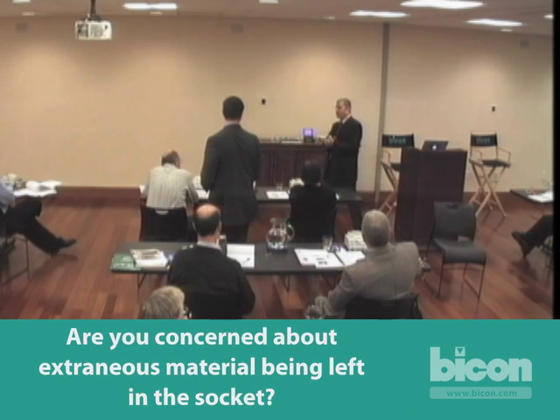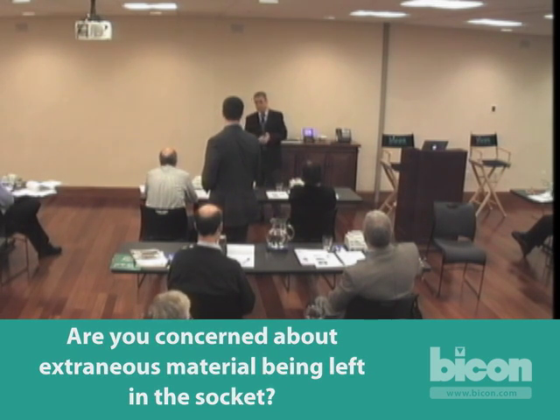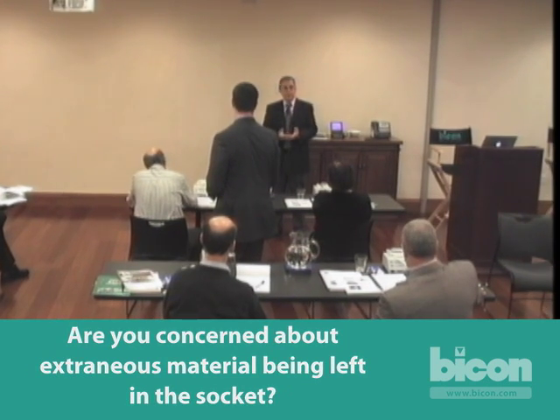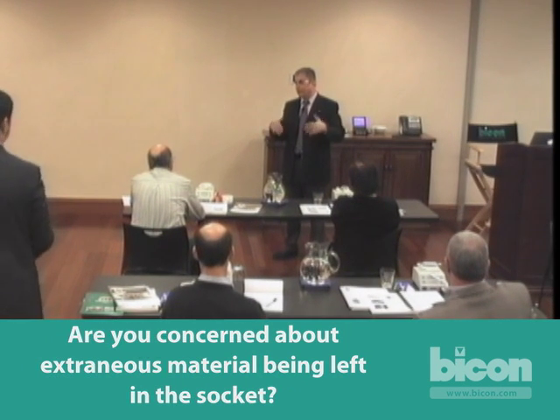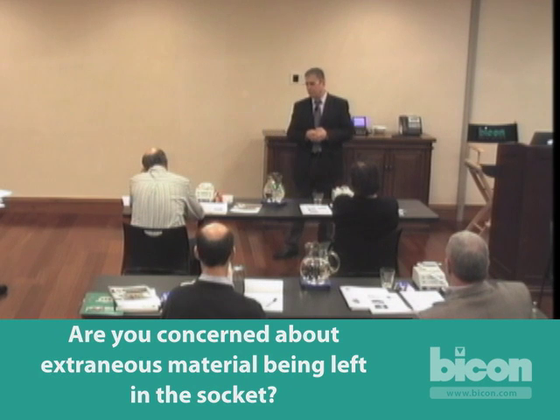If the implant is left in and you let it heal and come back at another time, it's still there anyway. We actually have better control when we do the extraction and place it simultaneously. The question is: what if there's something left in there? Your best shot at dealing with it is right at the extraction. When you have any extraneous material left in there, you really can't control it at all — as you saw, we worked diligently to remove all of it.